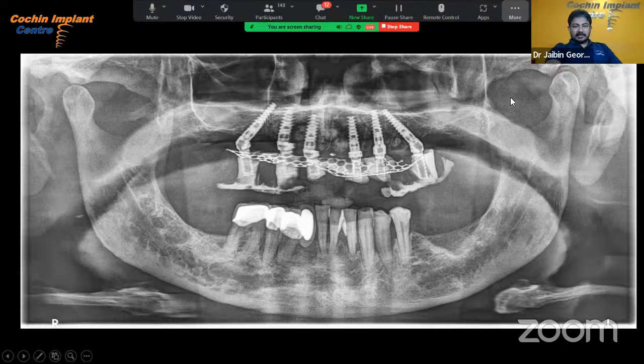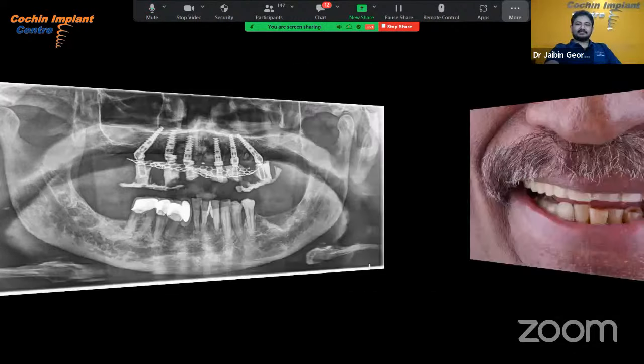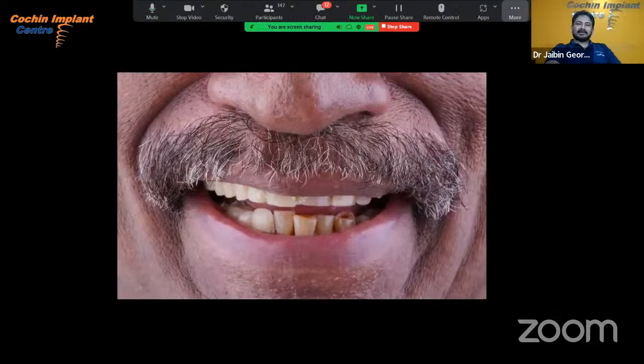You can see the titanium cylinders. The denture was reinforced with a mesh so that we have something rigid. So this is how the radiograph looks after a denture conversion. And this is the beautiful smile of the patient. This is the same day after surgery. Morning, the patient came. Afternoon, the patient left the office like this.